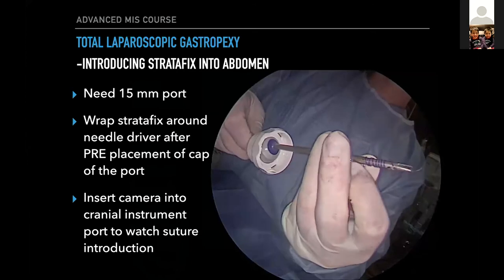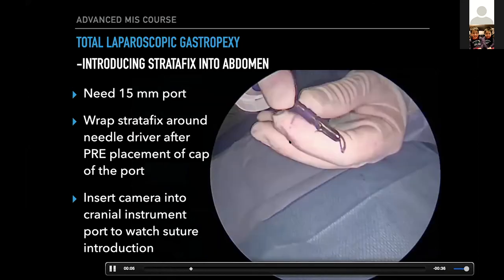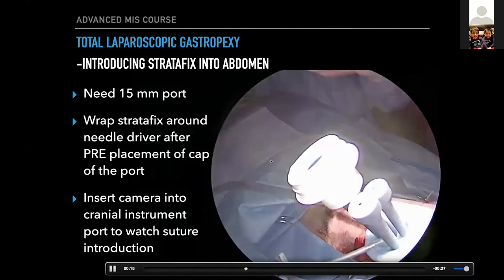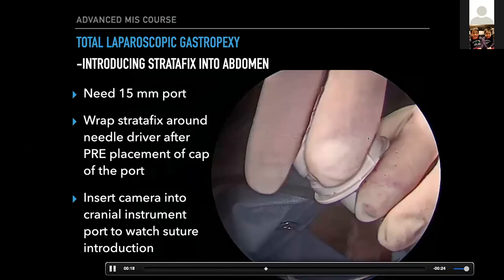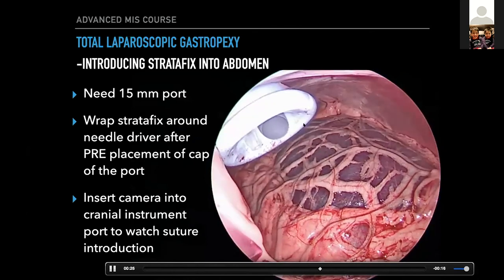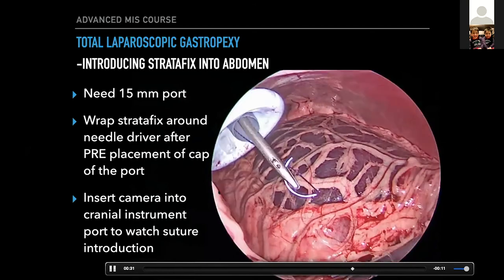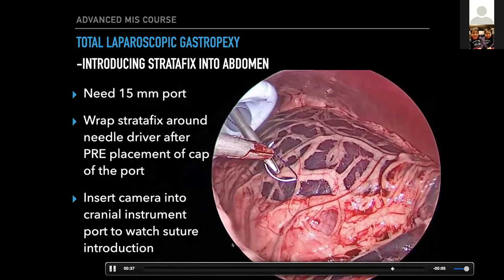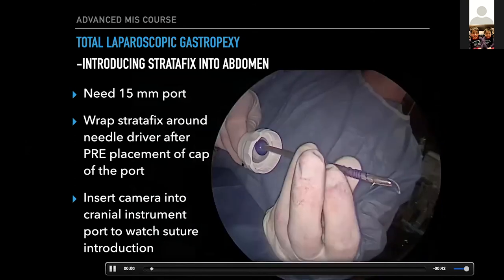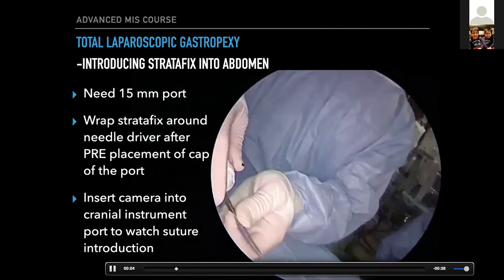For the StrataFix suture, here's exactly what I do to put it in. Take the needle driver out, take the cap off the port, preload it on your needle driver, and feed it through. You want to minimize loss of pneumoperitoneum because once your needle driver goes in, the valve is open and you'll lose pneumo. If you preload the cap and push the StrataFix in, it's fairly straightforward. I switch the camera to one of the cranial ports, drop in a needle driver, grab the suture, and bring the needle driver back into one of the cranial ports.